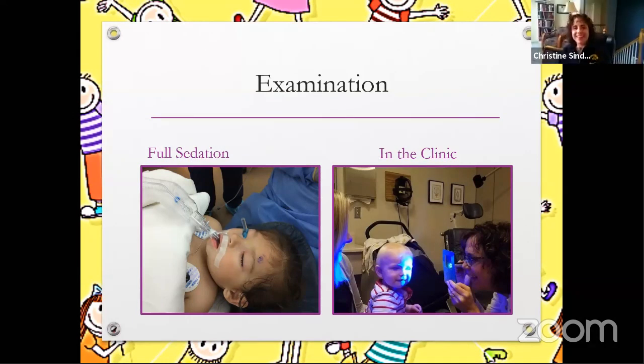You want to correct the full amount with contact lenses now. We can put some prism in the contact lens itself. With this impression technology, with iPrint, we can put prism in any direction that we want to. Typically what I do is correct the refractive error the full amount that I can, and then put the prism in the glasses over the top, just because the glasses offer protection to the ocular surface.